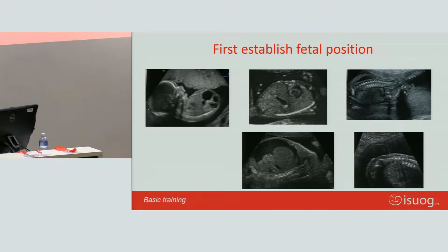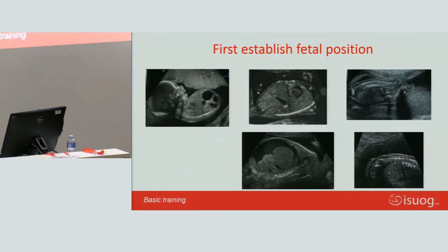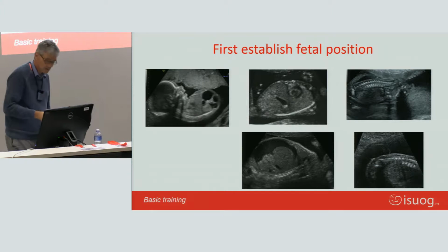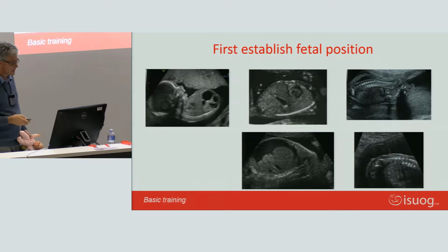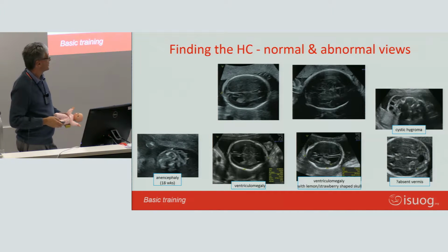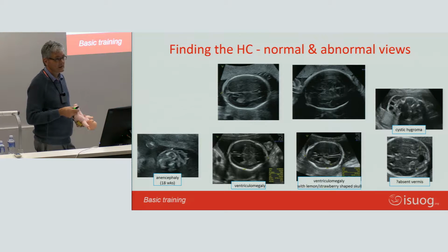So that's really, we're talking about abnormalities, and much of what you see there doesn't really look nice, but we will go to the more specific abnormalities. But firstly, remember how the baby's lying, because in the end, much of the right or left things really depends on that.